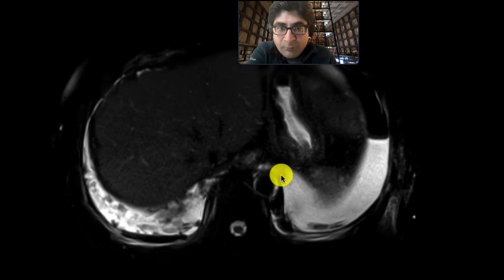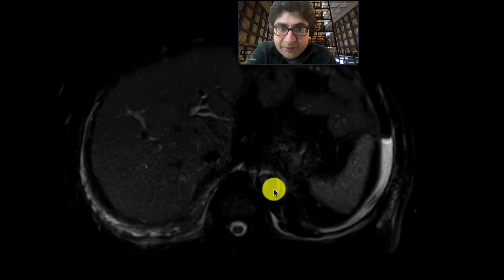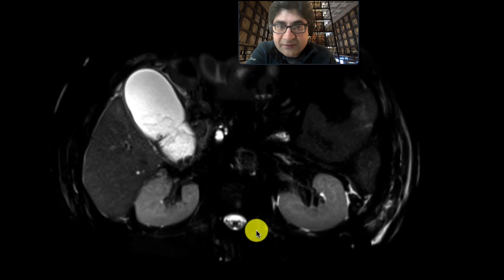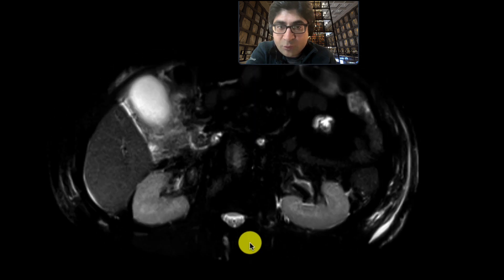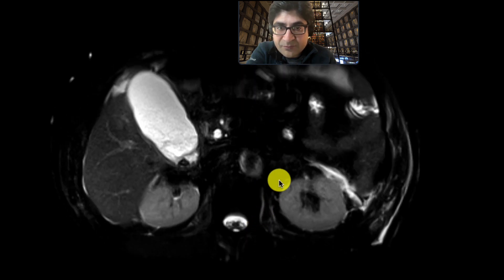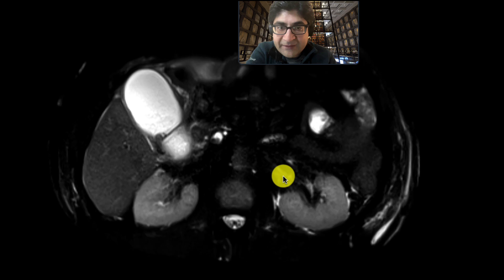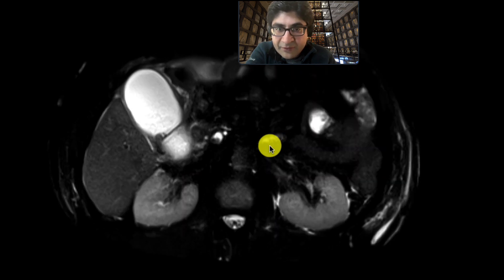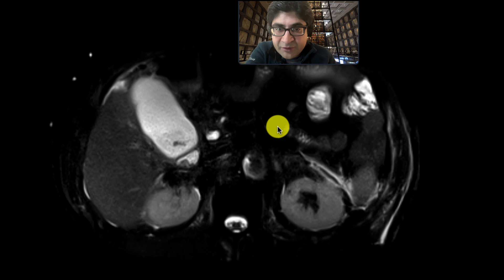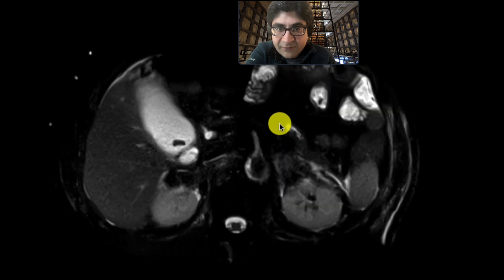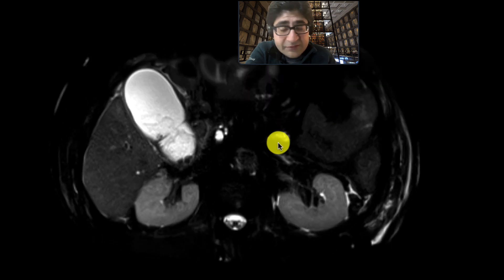Let's focus on the gallbladder and biliary tree. This is the T2 fat sat sequence, and we can immediately see that the gallbladder is quite distended — much bigger than we'd like it to be. There are fill-in defects over here, over here, and another one over here. These are going to be stones, and there's another fill-in defect floating in the gallbladder right over there.